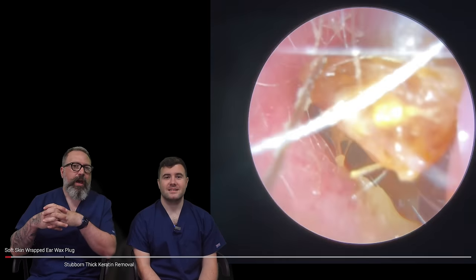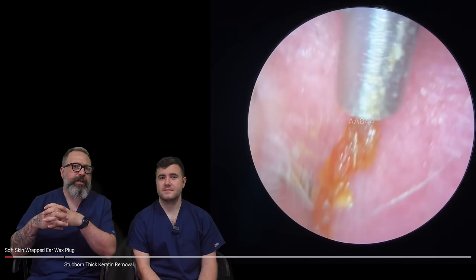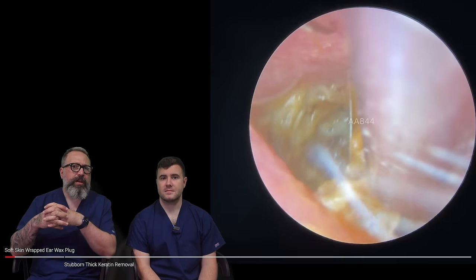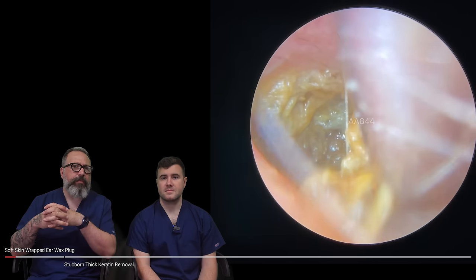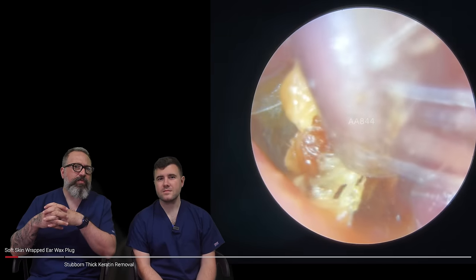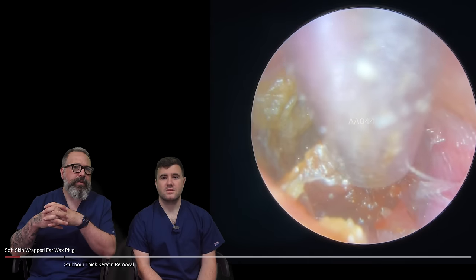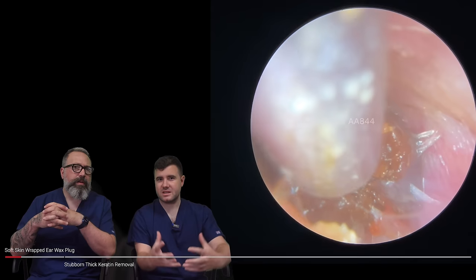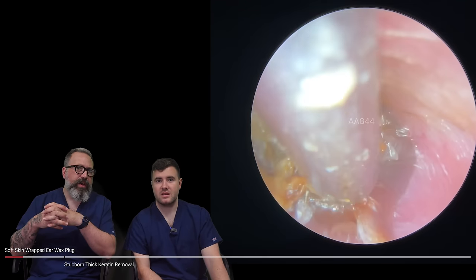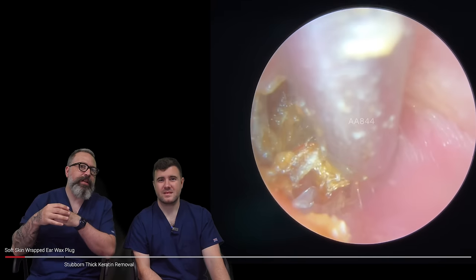I think this was a post-irrigation procedure looking at this because it does look a little bit wet. The patient may have been using a lot of drops inside the ear canal, but we're just getting a grip. You can see it's almost like a skin layer, really really deep in the canal here, right on top of the eardrum. It looks really really stuck to it — it's right over the front of the eardrum, sort of radiating here. You can even see where it's kind of lifting and peeling from the side of the canal wall.